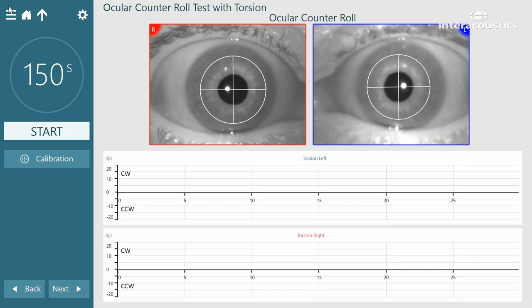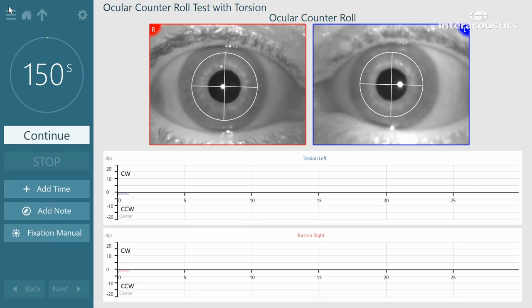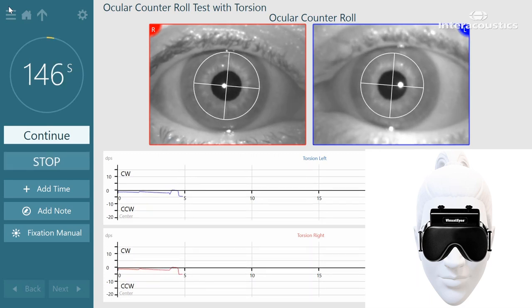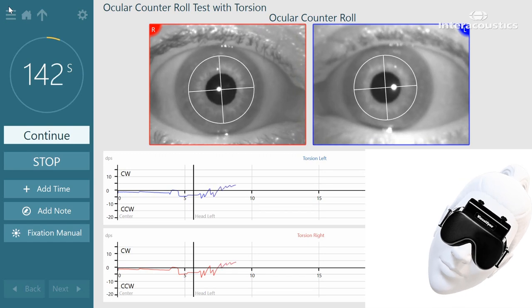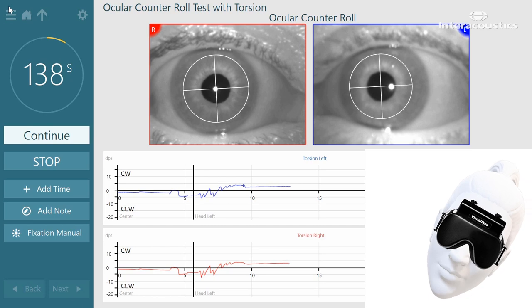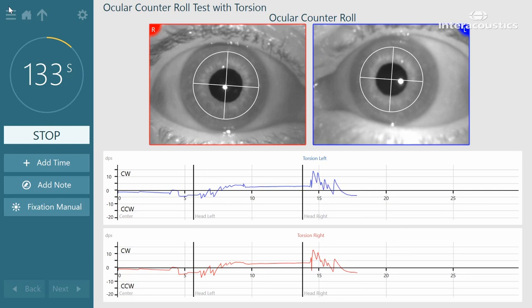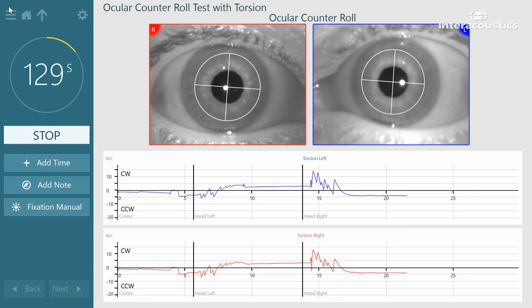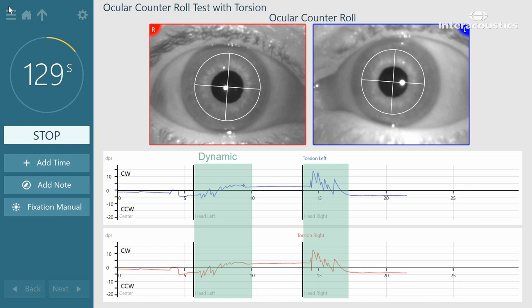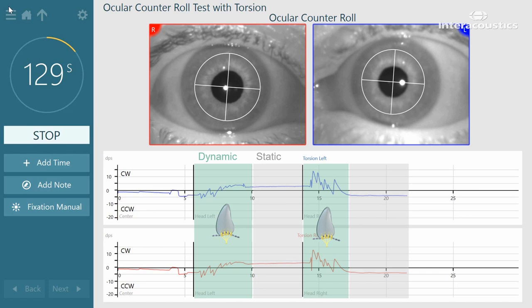Here you see the torsional eye movement recordings during the ocular counter roll test. First, the head is upright, and after a few seconds, the head is tilted to the left. Again, after a few seconds, the head is brought back to the upright position and then tilted to the right. The response consists of two components. The dynamic component is the transient nystagmus that begins during or shortly after the head tilt and lasts for several seconds. This component is mediated primarily by the vertical semicircular canals with minimal contribution from the otoliths. The static component of OCR is the persistent torsion of the eye position that lasts as long as the head is tilted. This component is mediated by the otoliths and their central pathways.